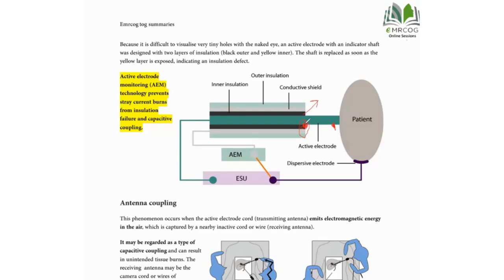The energy is collected up because there are two physical differences between the active electrode and the insulation material. One is plastic and one is metallic. This is going to make the energy pack up here, collected, and once you turn up your device, this energy is going to escape to a nearby organ. So the injury is not going to be noticed by your eyes at once because it's outside the scope of your working area. Not like the insulation failure.